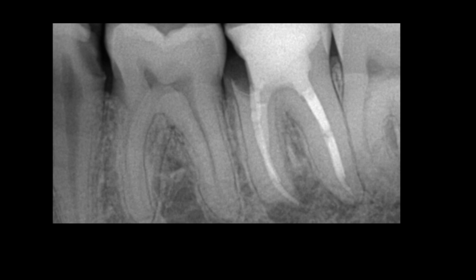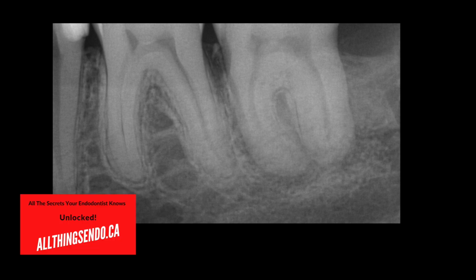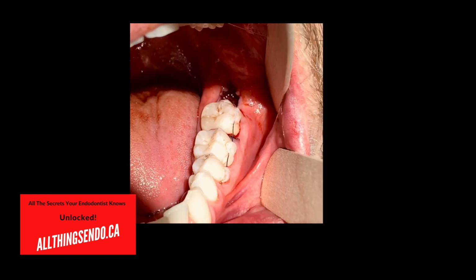Unfortunately, I wasn't able to get any video coverage perioperative, so during the operation, the tooth is now extracted, 3.7, and then this is placed in the socket. It seemed to fit, and you probably would never even know this was an 8 in the spot of a 7. That was 6 months ago. This is now the post-operative radiograph taken with the 014 nickel titanium wire, and the tooth is in place.